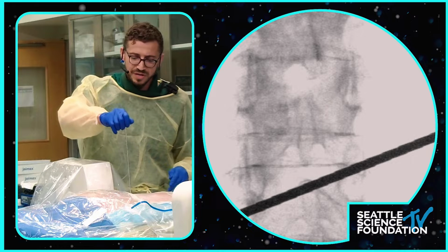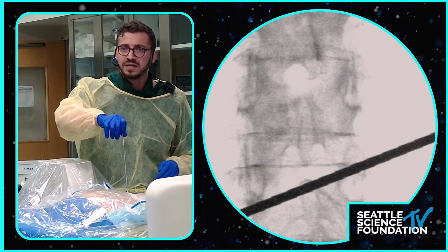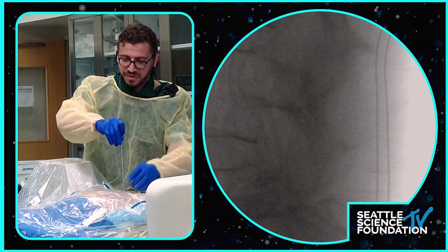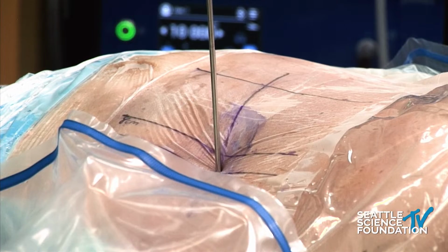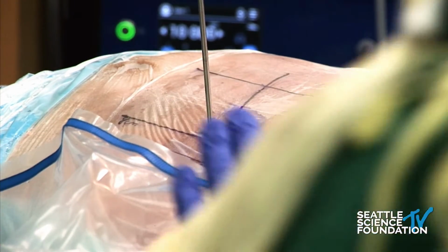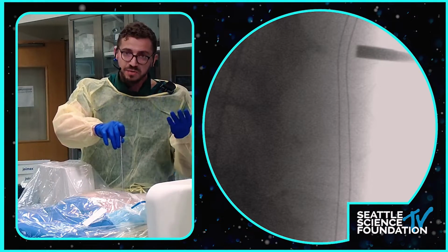So what you want to do is put an instrument to touch the skin, and there are many ways of doing it, but this is the way that I think is the easiest. X-ray there, please. I don't see the instrument there. X-ray here, please. So you start seeing it now, starting to touch where the line connecting all the spinous processes is. But again, as you go more lateral, that line becomes more curved. So here it's between the facet joint line and the spinous process line. So this is a good place to start.